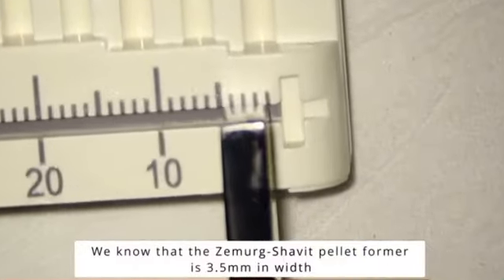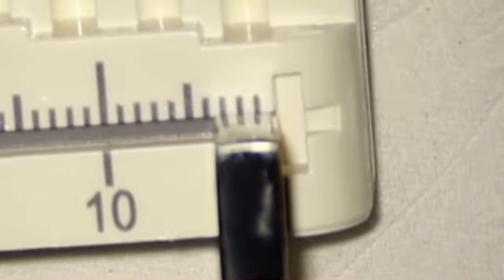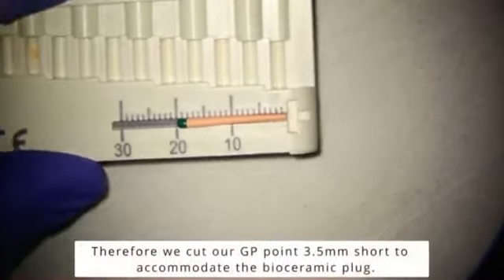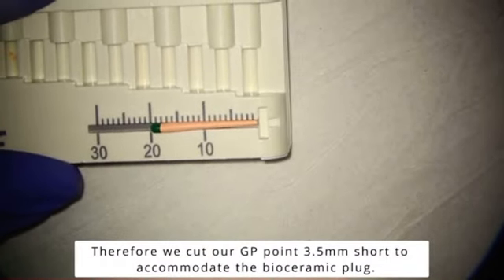We know the width of the pelletformer is 3.5 millimeters. Therefore, we take our custom GP point and cut 3.5 millimeters off the end.